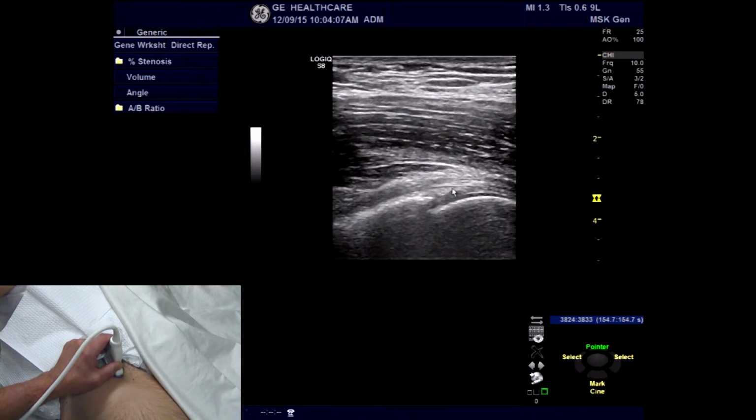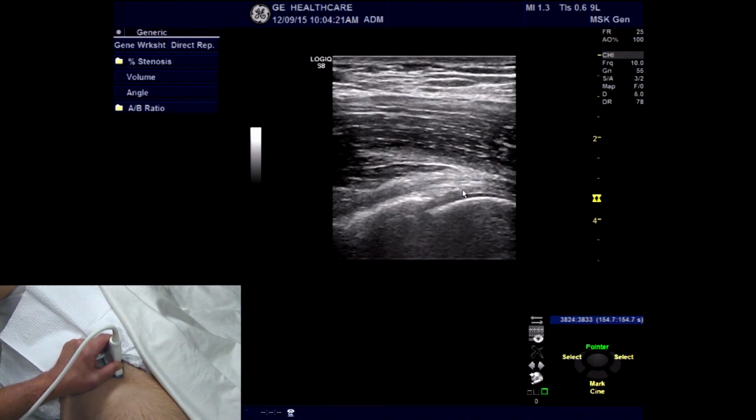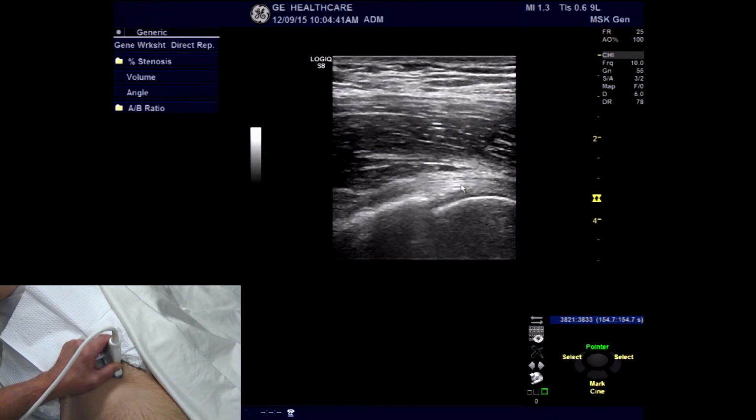And then in direct contact and superficial to the labrum is going to be the ligamental structure that makes up the capsule of the hip. And there are several ligaments that make this capsule of the hip, but important to realize that going from the bone surface more superficial, we're going to see the femoral head, the articular cartilage, the labrum of the hip, which is going to be the structure right here, then the ligament and capsular structure that sits just superficial to that.